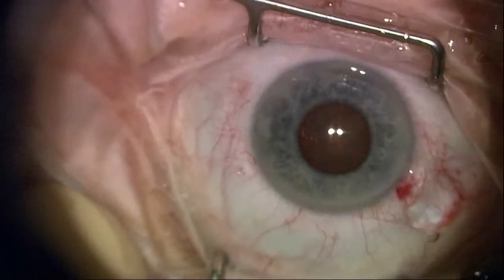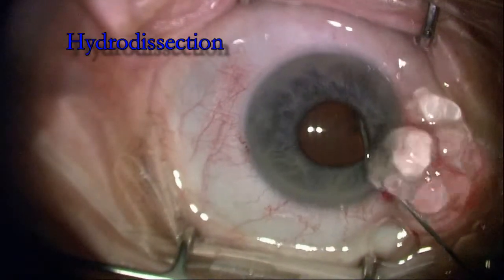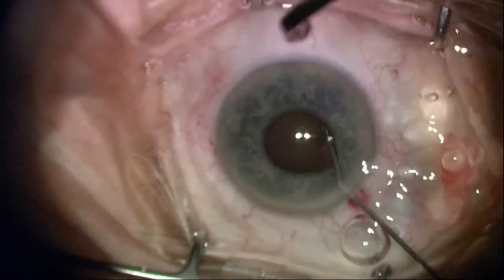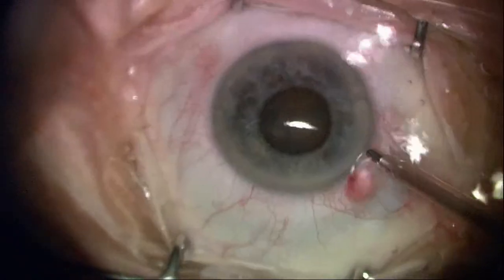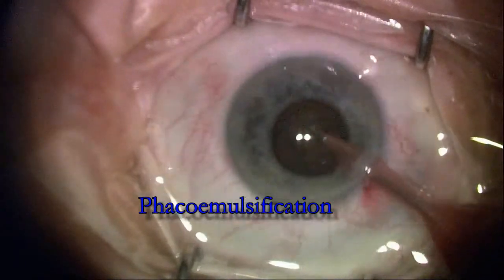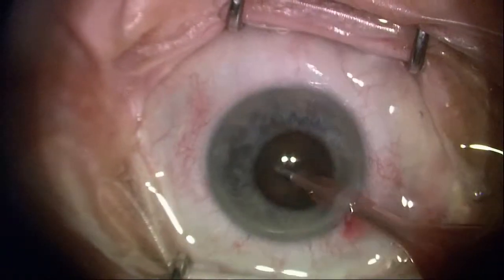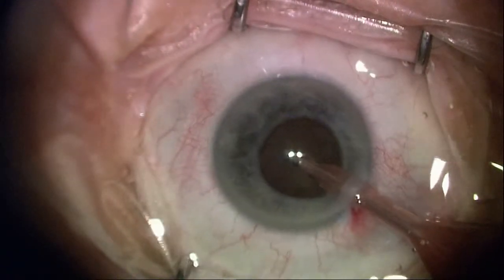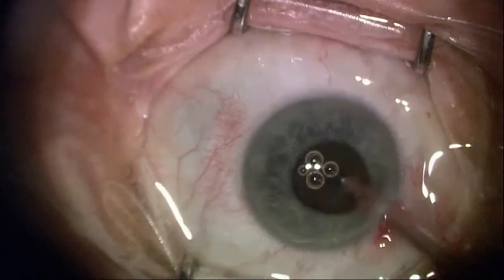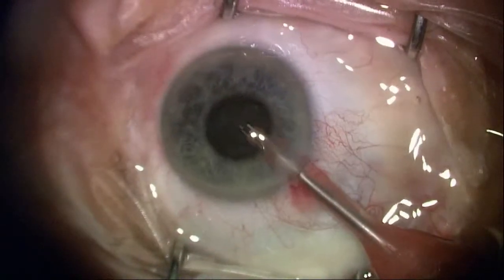I'm going to do a meticulous hydrodissection. This is for cortical cleaving, but I want to make sure that I don't do it so aggressively that I get an iris prolapse. You can see I'm going to be extremely respectful of the pupil and the iris. I'm going bevel down right now in an effort to maintain maximum occlusion and reduce turbulence that could end up injuring the iris.